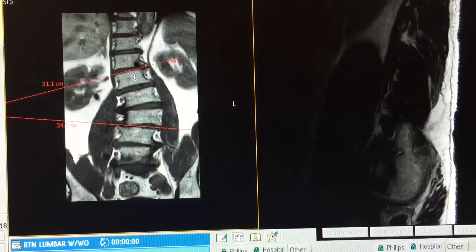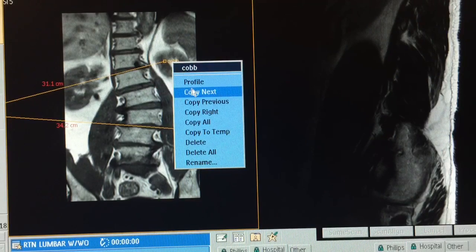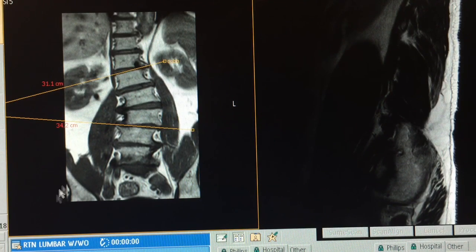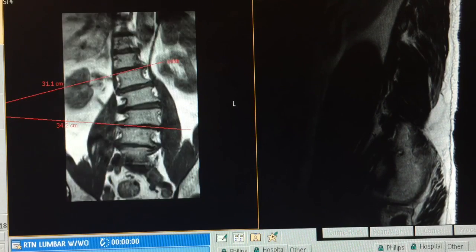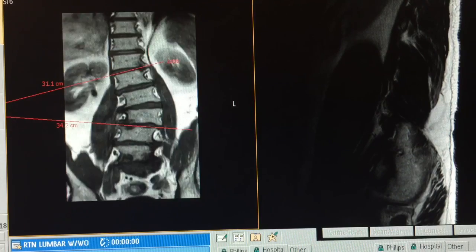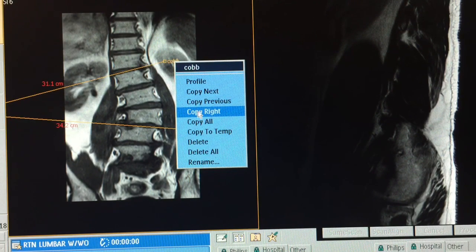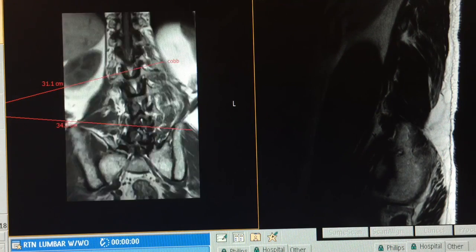You also have a right-click option here — you have to be hovering over the Cobb angle name. When you hover over the angle's name and right-click, you get options to copy to right or copy all. Copy to all means the lines remain visible as you scroll through slices anterior to posterior, useful when the spine curves in all three dimensions. If you select copy to right, the lines will remain visible from the current slice number onward and then disappear afterwards.